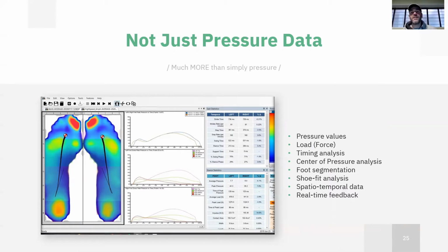We can obtain pressure values. We can obtain load and force values. We can obtain timing and time-related variables. We can obtain measurement about the center of pressure development. We can obtain information about different parts of the foot.